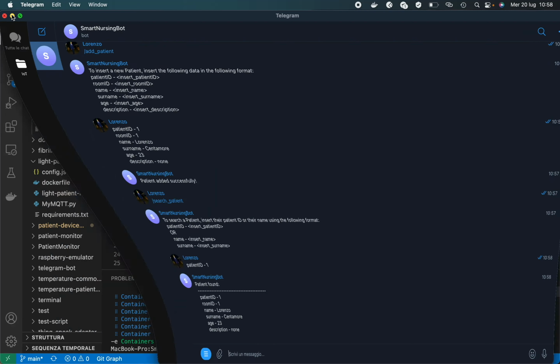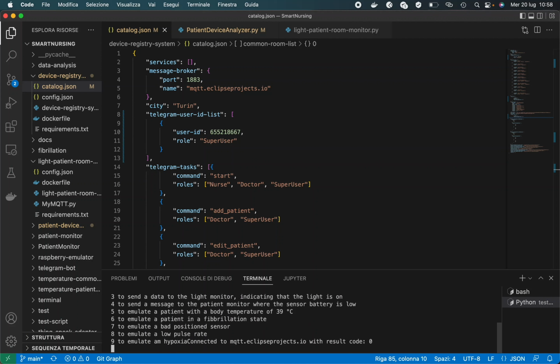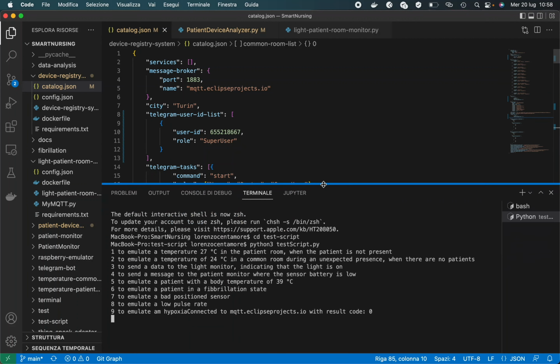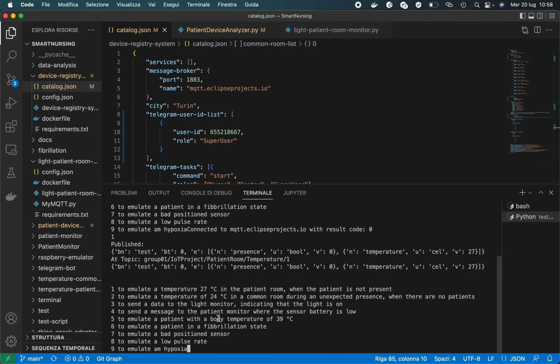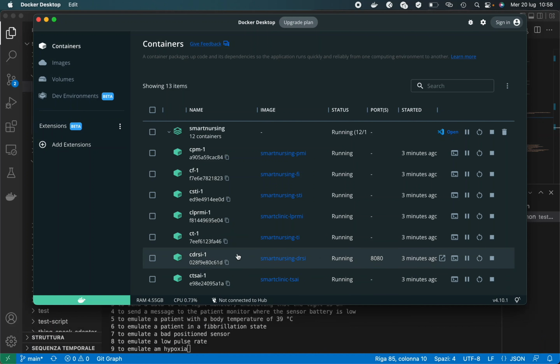To see the behavior and the output of the microservices, I will run a script that sends specific data to the microservices in order to emulate a particular condition. I can emulate 9 cases for rooms and for patients. Starting by pressing 1, I can emulate a temperature of 27 degrees during summer in a patient room without the presence of patients. Let's now open the container's terminal and see the actuation command sent.